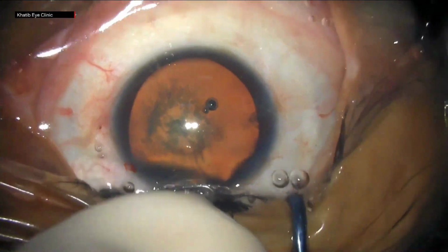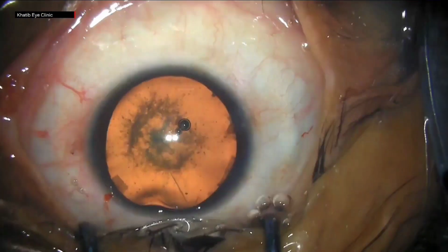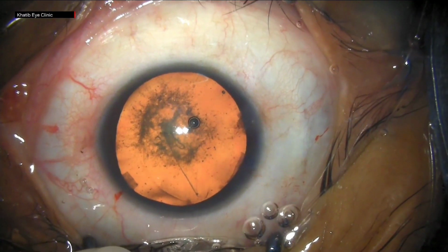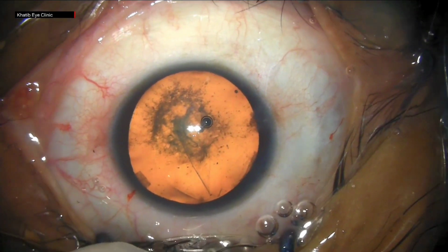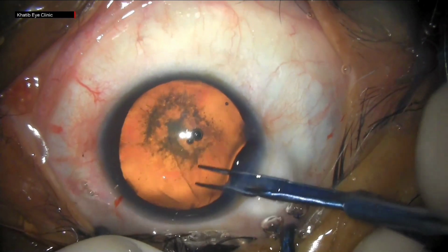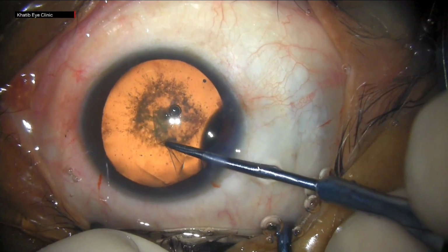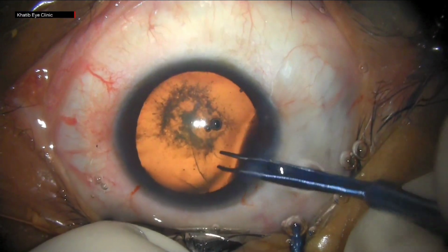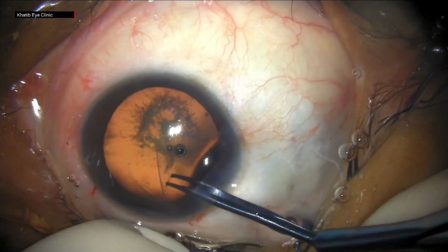Now the first thing I do is I try to get a better view. I can see that the Rhexis is nearly at the zonules. This is even more difficult than the previous situation because this is a sub-incisional runout. But even at this point, it should be salvageable. I apply the same principles. I pull in opposite to the direction of the runout. But as I'm trying to grab the capsule, we can see since it is sub-incisional with a deep anterior chamber, the wound is getting pressed, leading to egress of OVD.